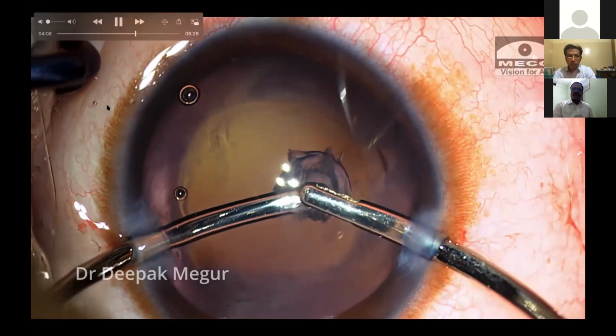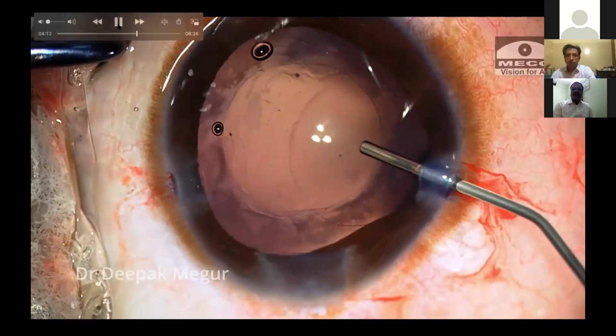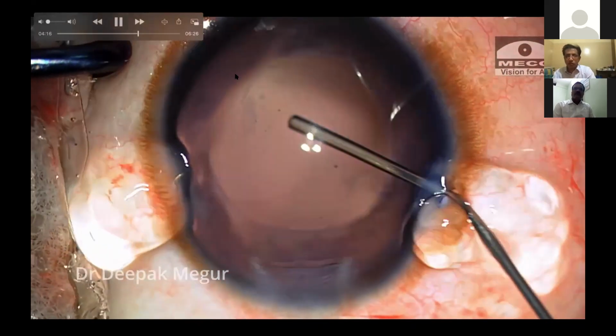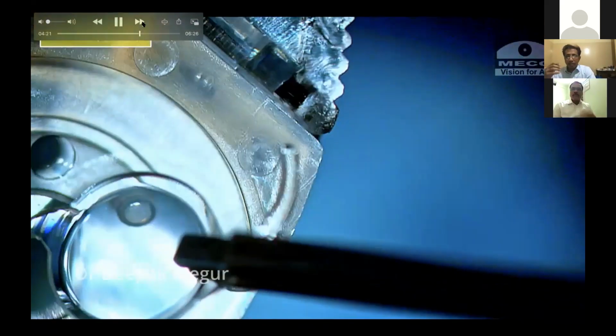And now I'm just filling the OVD into the bag, and then I have to just place the lens inside. That's all I have to do. And what I'm doing, I'm injecting viscoelastic and then go back and load the lens here. And a surprise is awaiting me before I implant the lens.